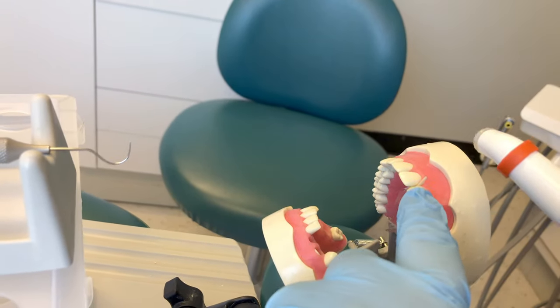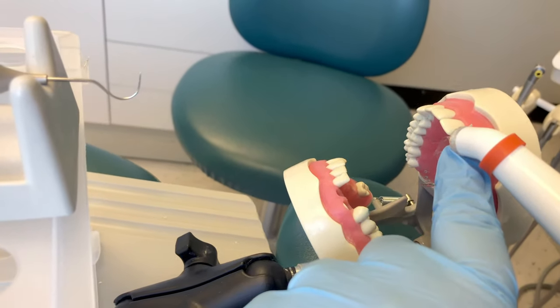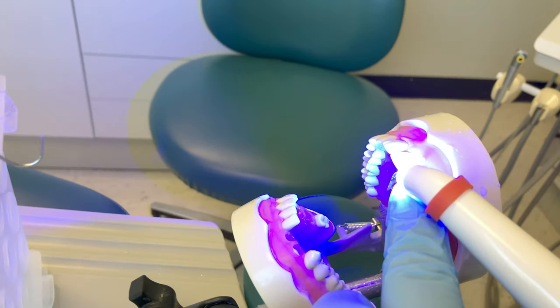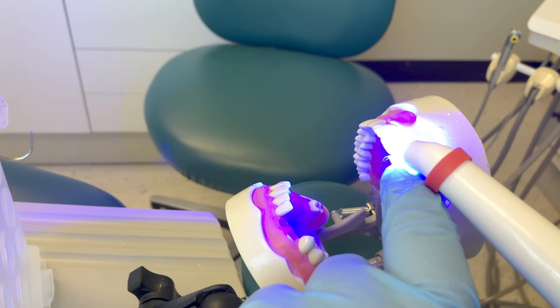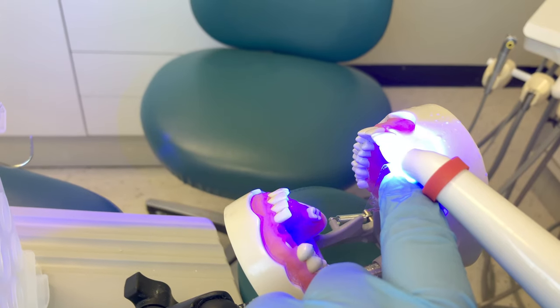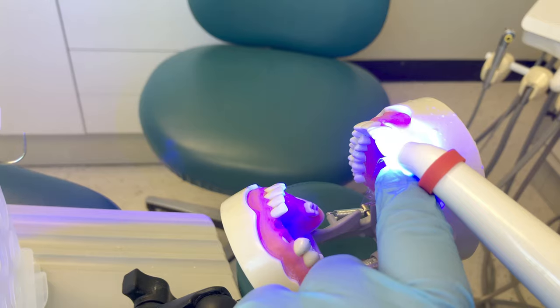Pick up the curing light with your other hand and light cure this layer of flowable composite. This flowable material needs to be light cured for a total of 10 seconds. The doctor uses flowable to get down to the deeper crevices of the preparation.